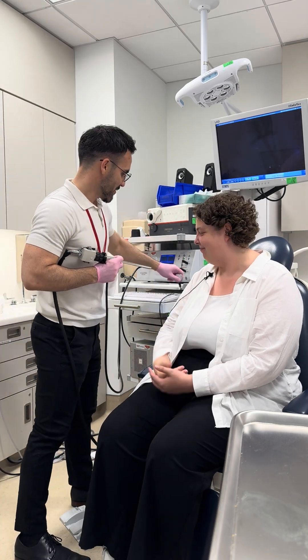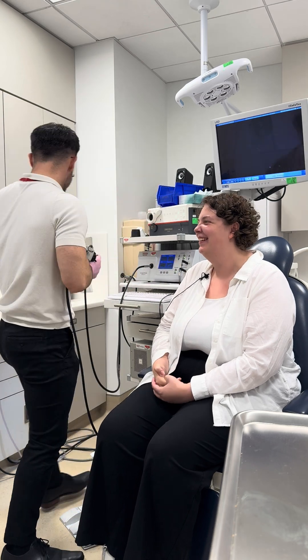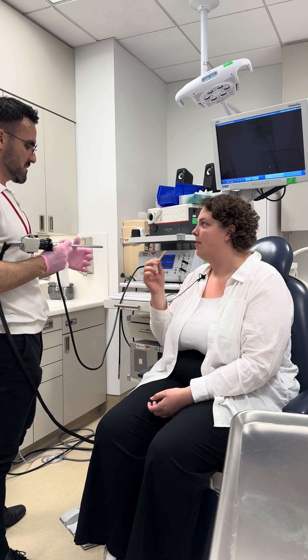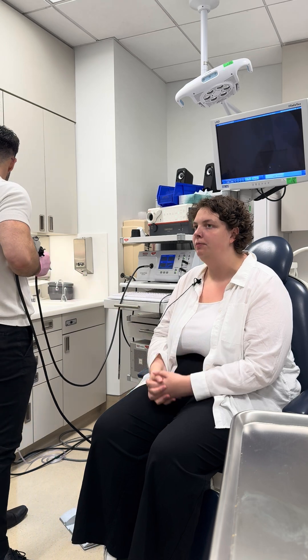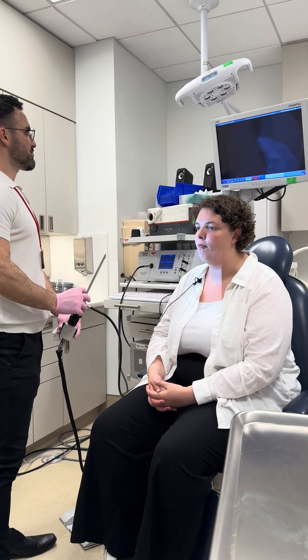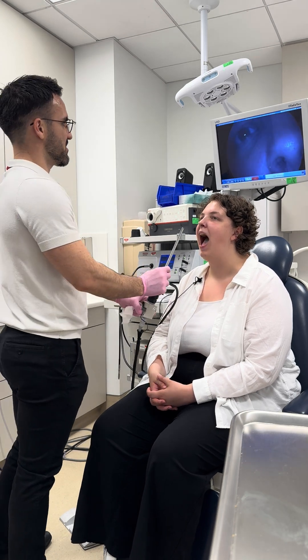So I'll take this from you now. Now what we're gonna do is have you take a bite of some cracker. Take a normal size bite, whatever's normal for you. And I can take that from you. Just do one swallow — try not to do any extra swallows. I'm gonna record this. Okay, good. I'm gonna open up your mouth, let's take a peek in there.